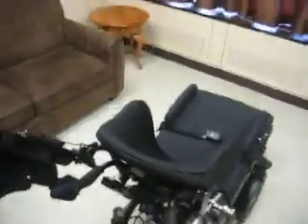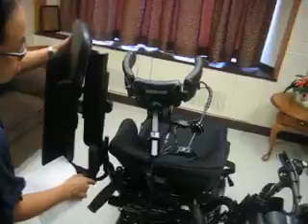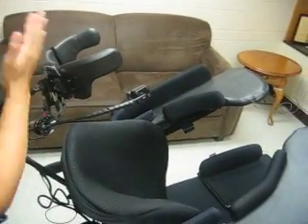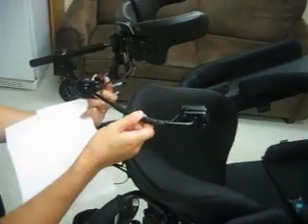Snap the head array back into place. Lift and it will lock in place, and place the arms on the armrests. You may need to swing away the cheek switch before you bring the head array into place. To release the cheek switch, pull out in the direction of the arrow, and this unlocks.